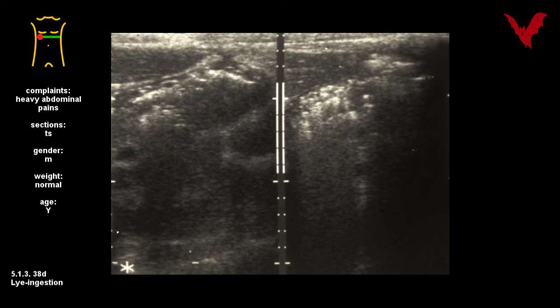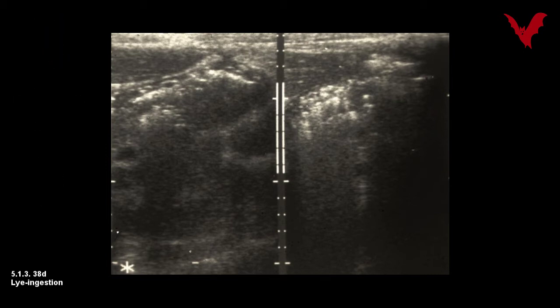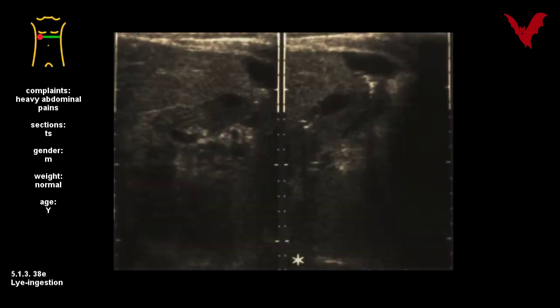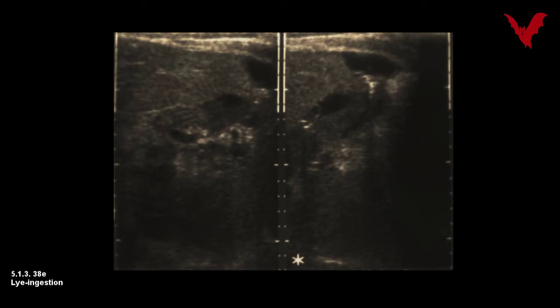In a suicidal attempt this liquid was ingested; some hours later intramural gastric gas was found in 38d, whereas a general right-sided swelling was described in 38e the day after. The patient survived after gastrectomy.